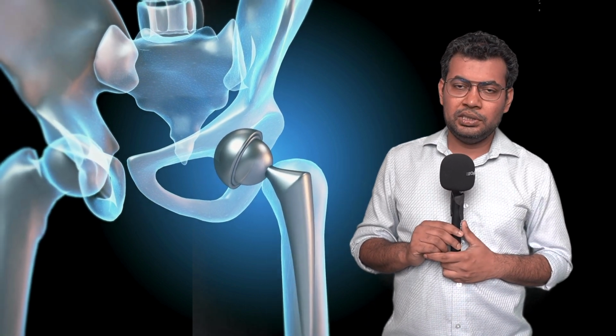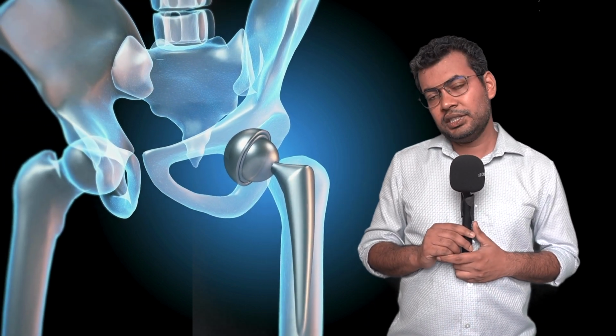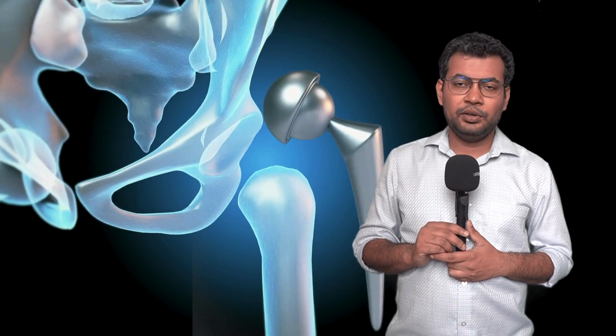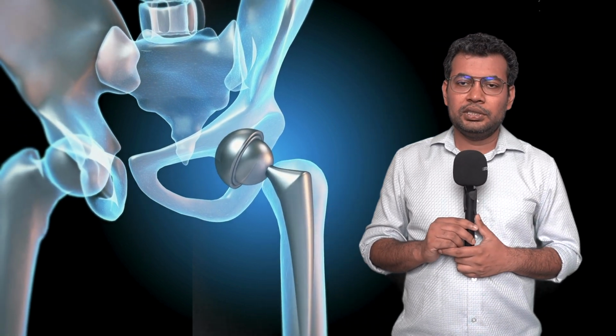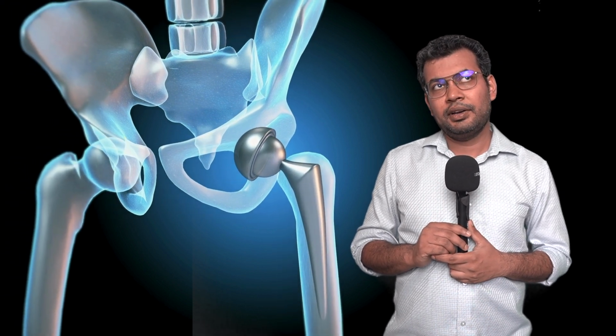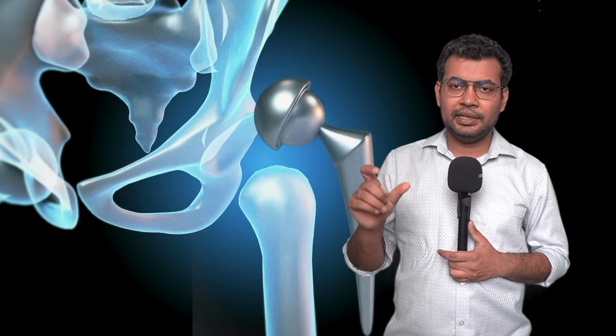So then we close the wound in layers. We put a drain. Post-operatively, we look at the drain. When the drain is less than 50, we remove the drain, and around 14-15 days after the surgery, we remove the sutures.